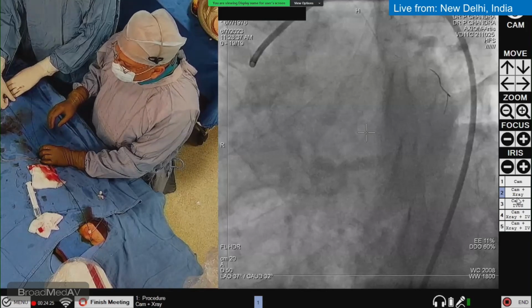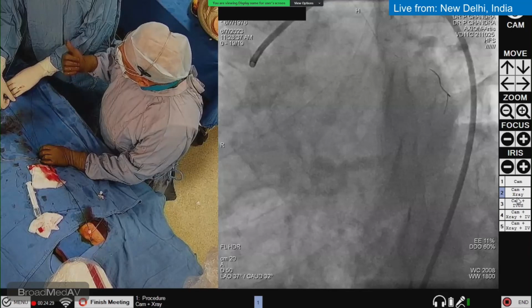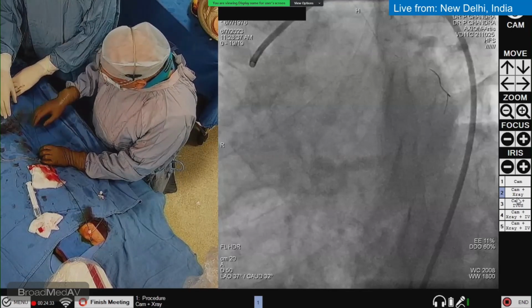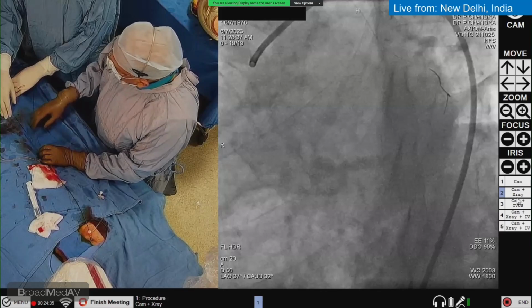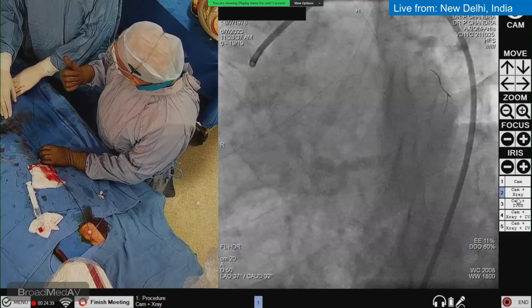And today we have a patient who is 47 years old, and Dr. Abhinav, who is with me, and Dr. Siddharth are going to be here in this case for the next 1 hour. So, Dr. Abhinav, you know the case?